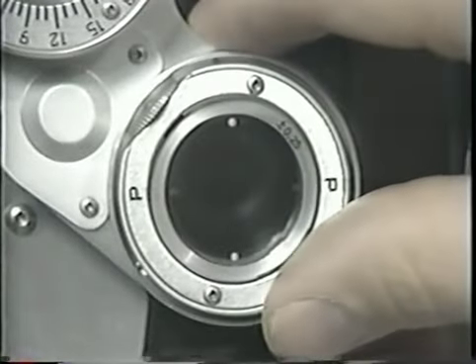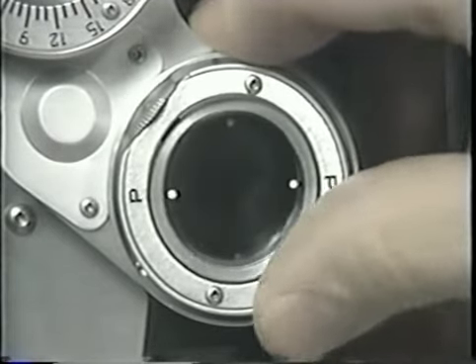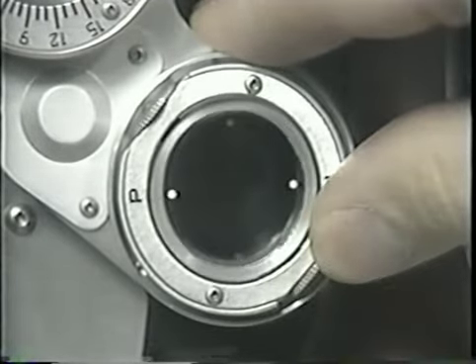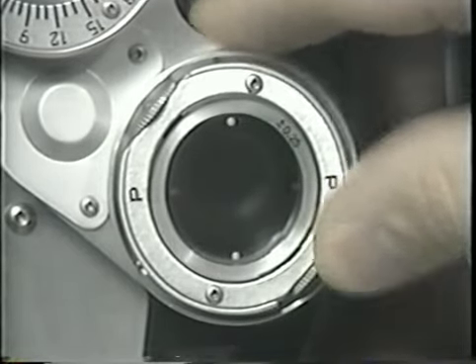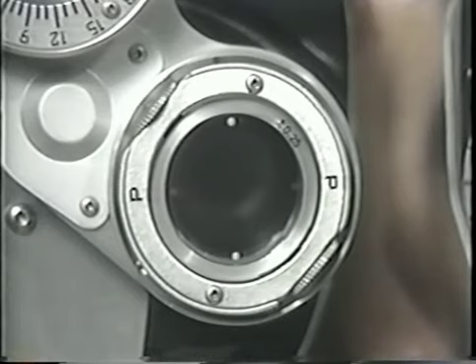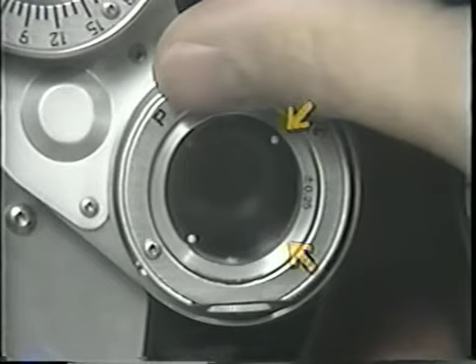Okay, now watch closely. I'm going to give you a choice. Which is better? 1, or 2? 1 or 2? They're about the same. Good. Before concluding that there is no astigmatism, the test must be performed in a second orientation, preferably with the cross-cylinder axes in the 45 and 135 degree meridians.